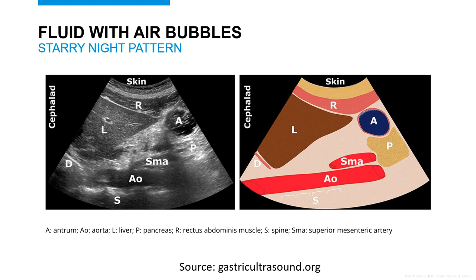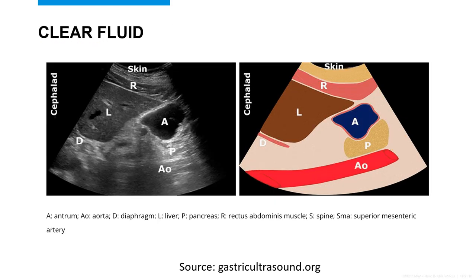That air came from either the patient swallowing while drinking, or from drinking an effervescent liquid such as sparkling water. Here we see the homogeneous dark hypoechoic appearance of clear liquid without any air. It's natural for your stomach to create clear gastric fluid. As a clinician, we need to discern whether this clear liquid is just naturally produced gastric fluid or whether someone recently drank a significant amount of clear liquids.